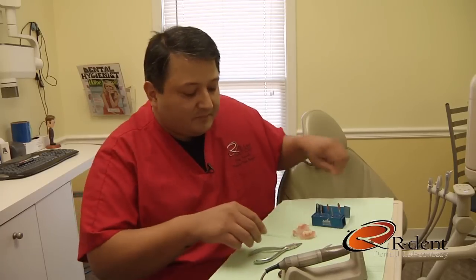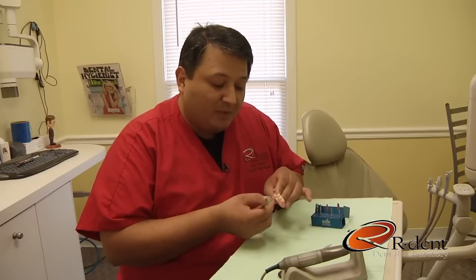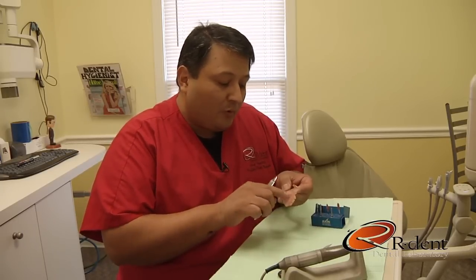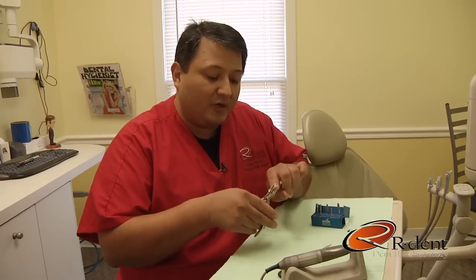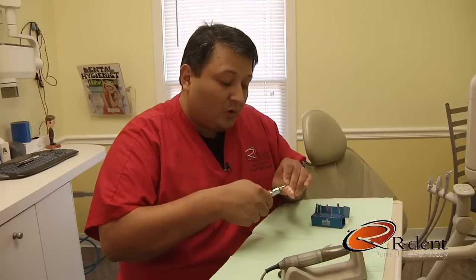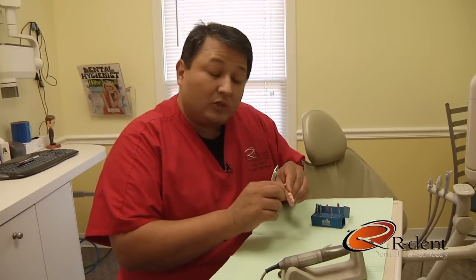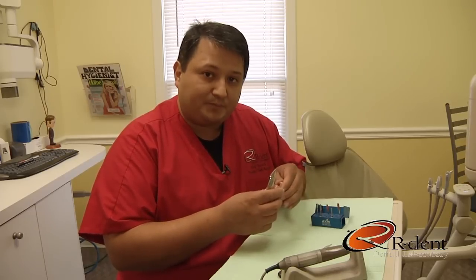Final tip. When seating a Valplast partial, and you notice blanching around the gingiva of the abutment teeth, before relieving the tissue side of the partial, use some basic ortho pliers with no grooves or teeth. Grab the clasp at the base of the partial and bend upward toward the abutment tooth. This clasp will hold its position and you will not sacrifice the original design of the partial.